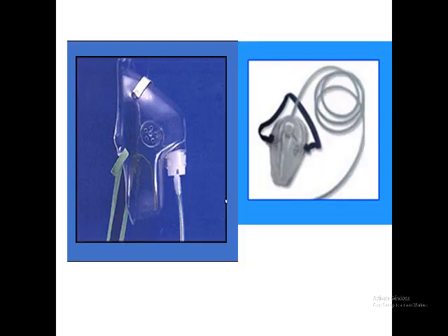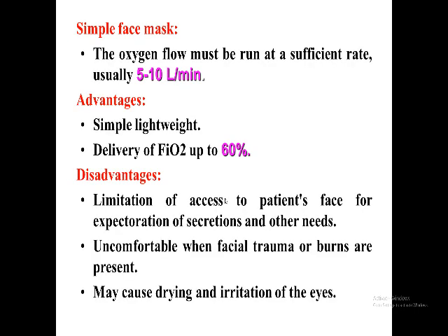As regards the face mask, oxygen flow is from 5 to 10 liters per minute. Advantage, it is a lightweight delivery that may reach up to 60%. So if I need to give more oxygen to the patient, I use a face mask, not a nasal cannula.